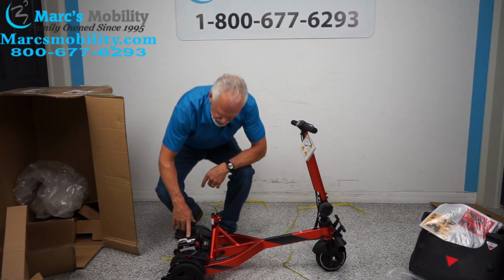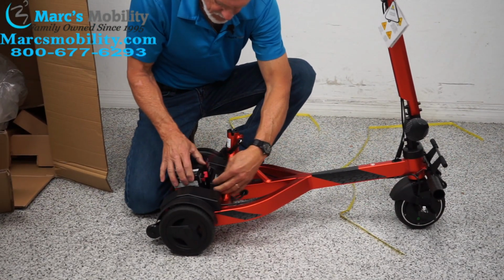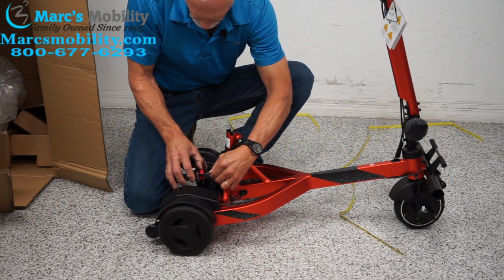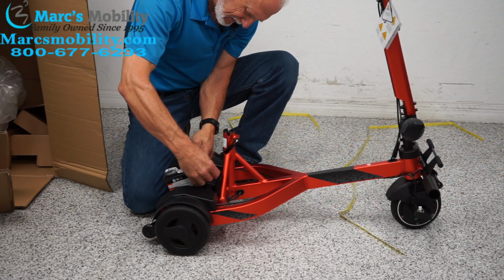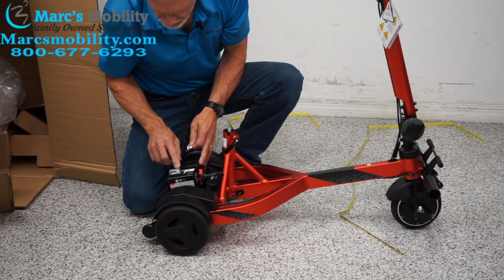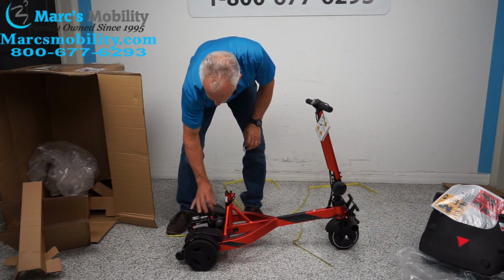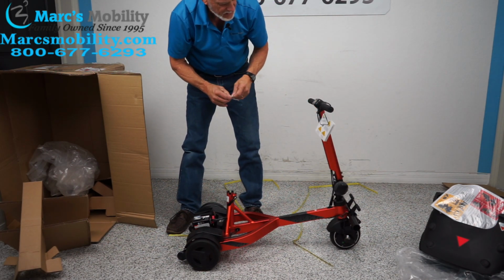The only thing you'll have to do when you get your battery is connect the power cable, and I think the power cable goes right here. If you pull this little tab right here and put the power cable here, and you don't want to force it, okay? So just make sure you put it in there without forcing it. Just like that, and then there's a tab right here. You pull this tab off, and then you can turn the button on, and that should give you power for the front, okay? Plugged in, power, and then you can hit your on button here, and you should be ready to go.